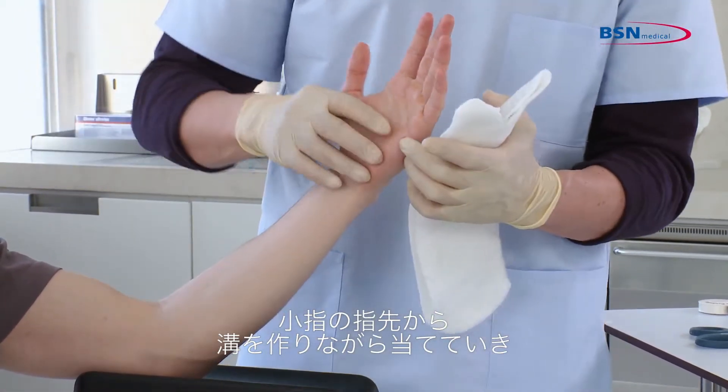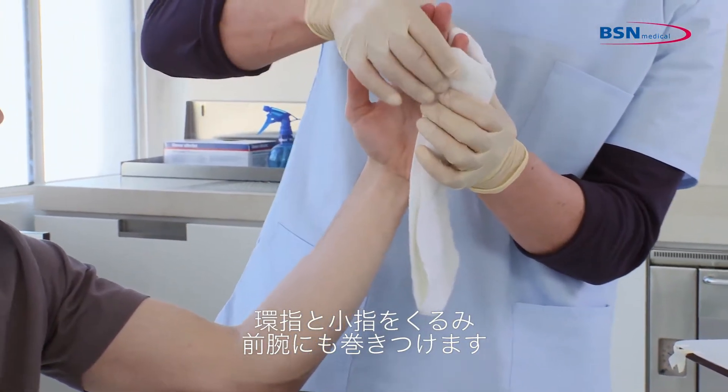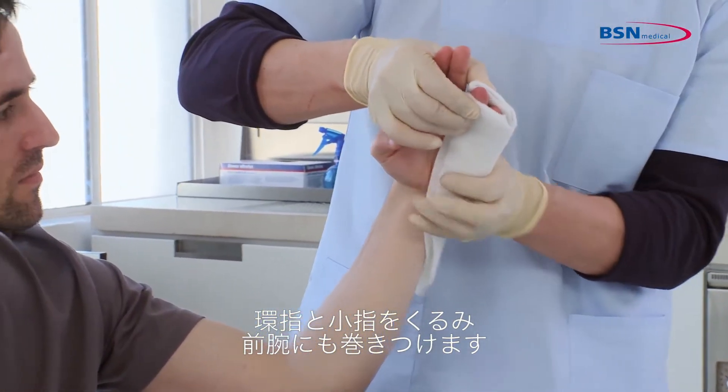Start at the tip of the fifth finger, creating a gutter. Hold the splint around the fourth and fifth finger and fold it around the arm.